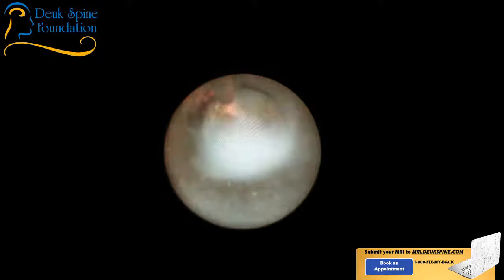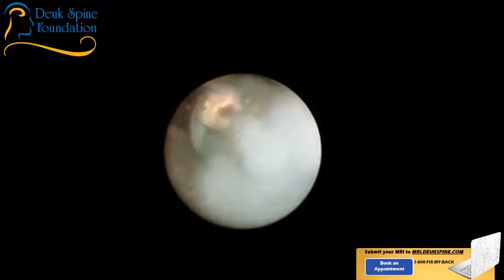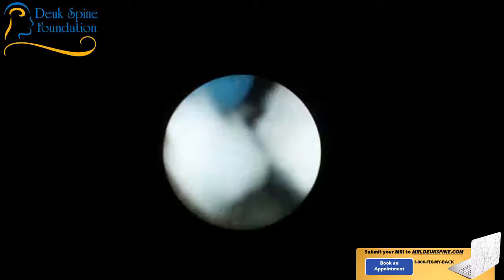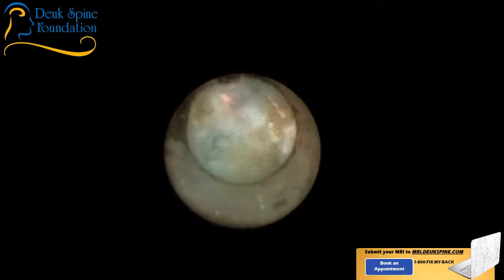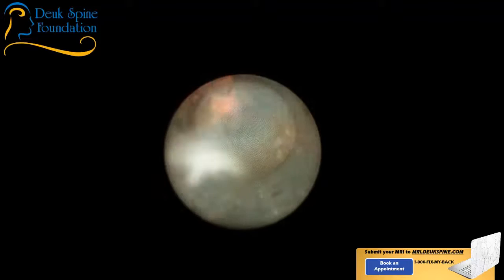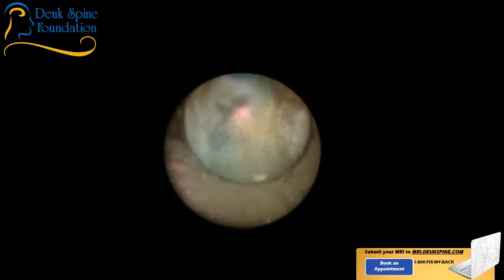There's no need to do fusion because we're not taking the whole disc out. We're not making a big incision. We're not destabilizing this area with our surgery. The laser does two things. It zaps or vaporizes, but this particular laser — we've selected it because it creates a pulse wave. A pulse wave is a pressure wave, an acoustic wave that blasts loose fragments out. So it's very helpful at not just vaporizing tissue, but also blasting herniations out.